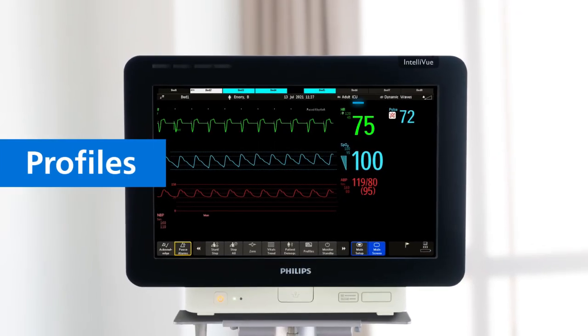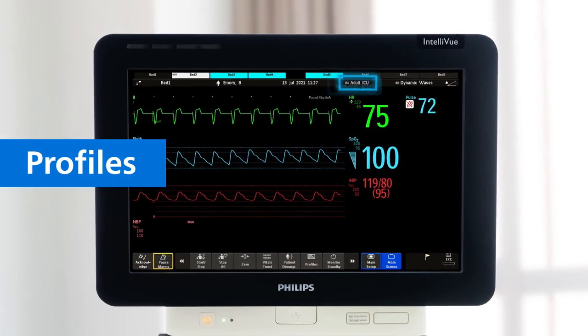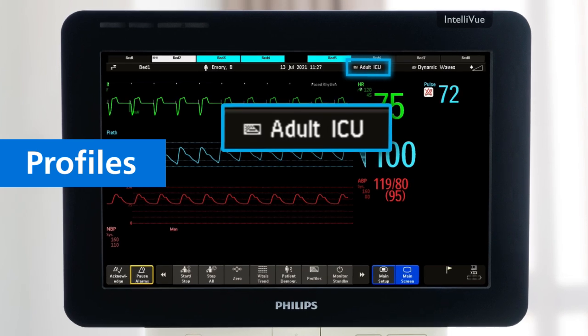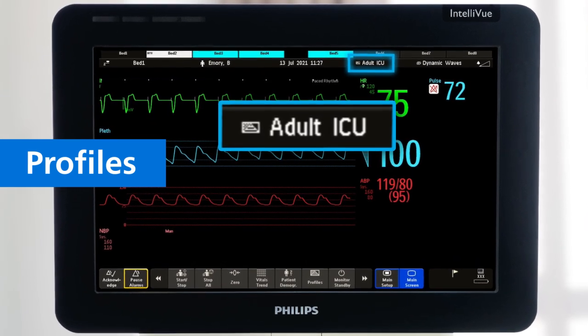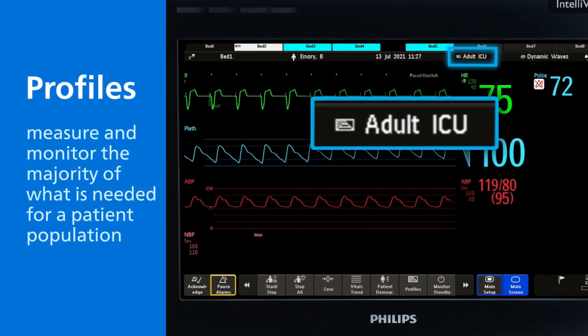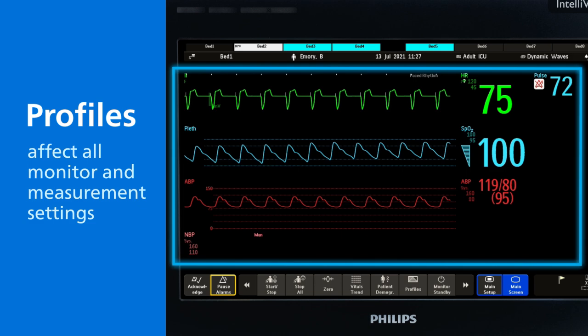Profiles are predefined monitor configurations that you can set as default for certain patient populations. Profiles enable you to measure and monitor the majority of what is needed for a patient population. Profiles affect all monitor and measurement settings.